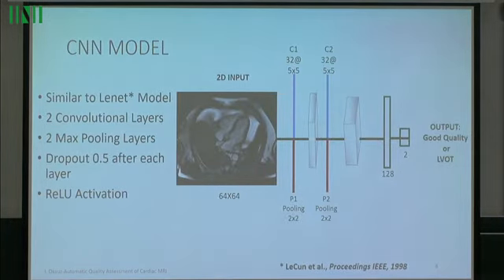So, the proposed network consists of 5 layers as illustrated in this figure. The architecture of our network follows the simple design of a LeNet architecture. The first layer is a convolutional layer, which filters the input with 32 kernels, each of size 5 times 5. In the convolutional layer, the locally normalized patches are convolved with 32 filters. Each filter generates a feature map.